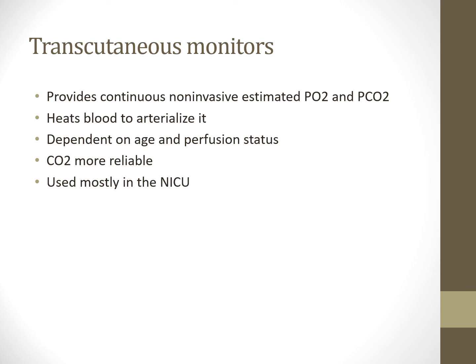So also know if they're on positive pressure ventilation and we make a change, and you see their end-tidal CO2 drop and you've somehow increased the amount of pressure or volume that the patient's getting, that could be a bad sign, right? That could be a bad sign if their end-tidal CO2 dropped after you make a ventilator change that increases settings, because you could be causing over-distension. You could be causing an alveolar dead space issue. Not good. That's trauma. That's ventilator-induced lung injury.